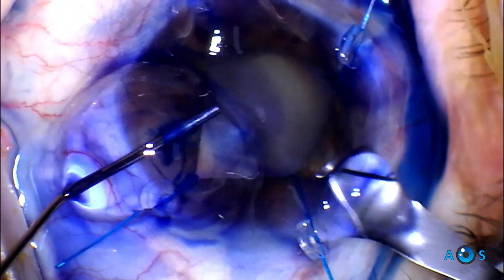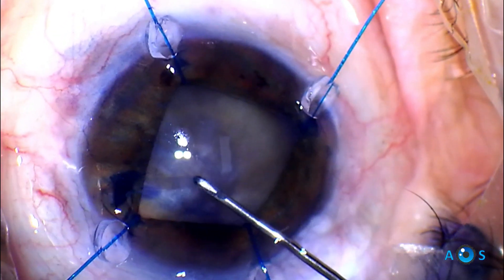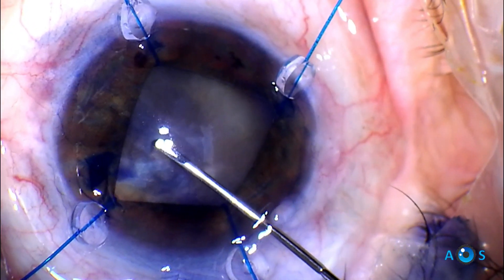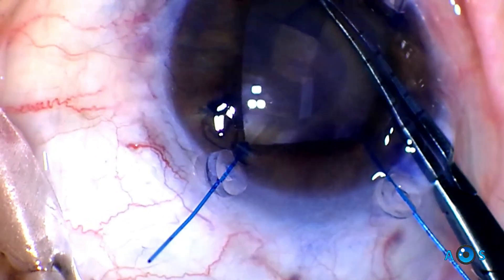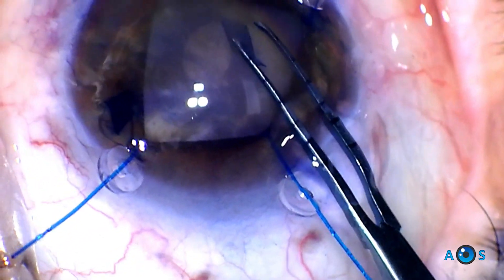Trypan Blue is used to stain the anterior capsule. A 2.4-millimeter incision is made, and now a cystitome is used to create a very small opening. Notice that even while puncturing the capsule, faint movement is noted of the lens capsular bag complex, so we know there is some degree of zonular dialysis.